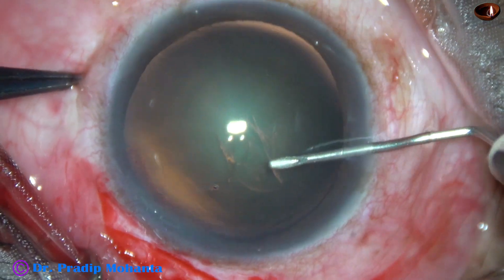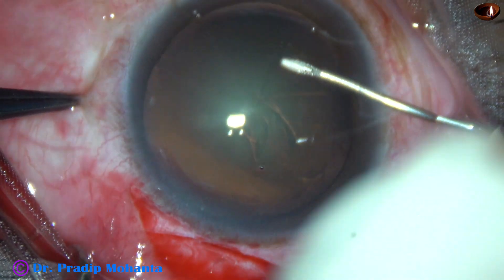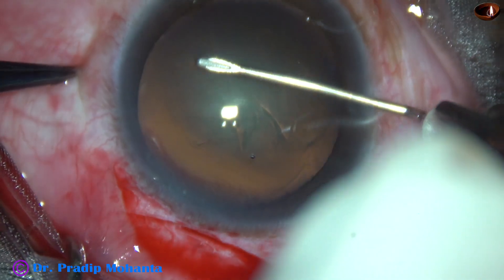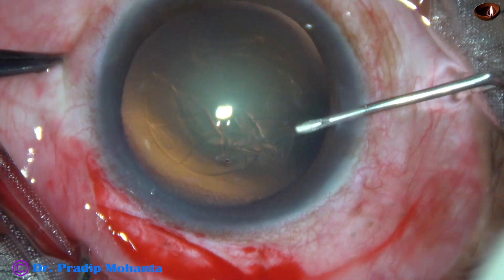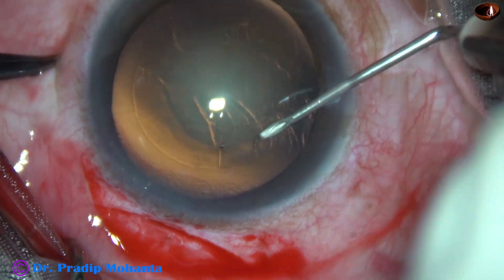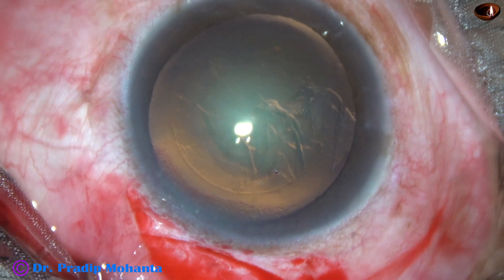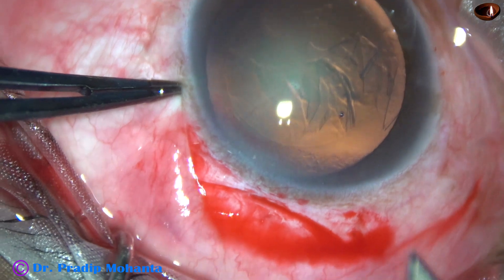The capsular tag is raised and guided by the needle itself — a 26-gauge disposable bent needle. A round, optimum-sized capsulorhexis is made. The size of this rhexis is about 5.5 mm.